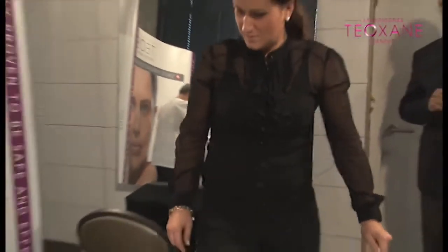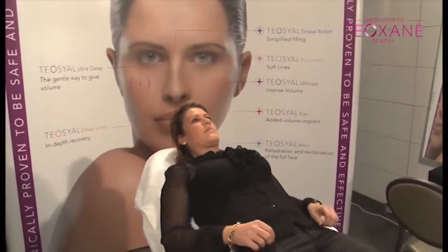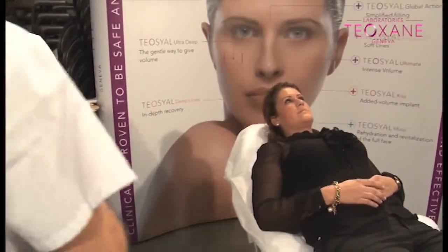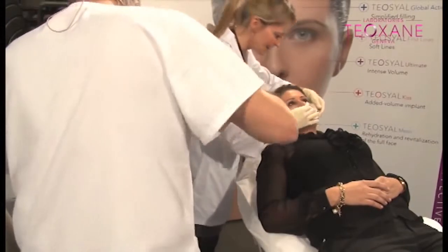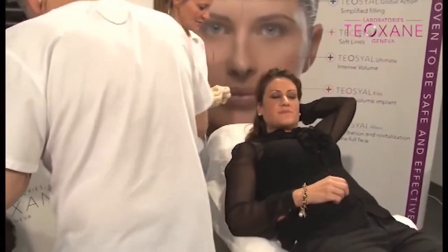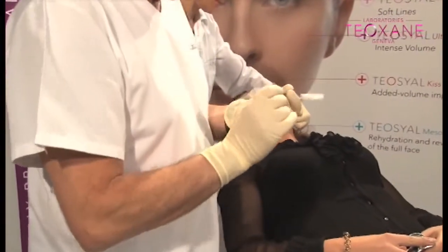This time I'm going to use the old-fashioned way, as I used to call it. I'll take a 30-gauge by 13 needle — yes, the 30-gauge needle, 30 by 13 — the classic yellow needle, global action.